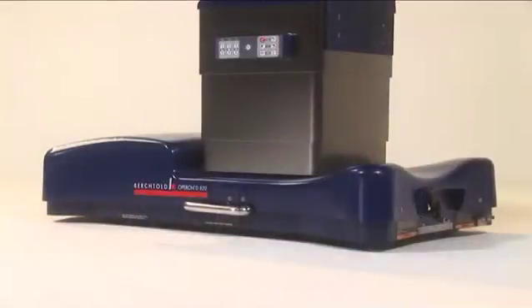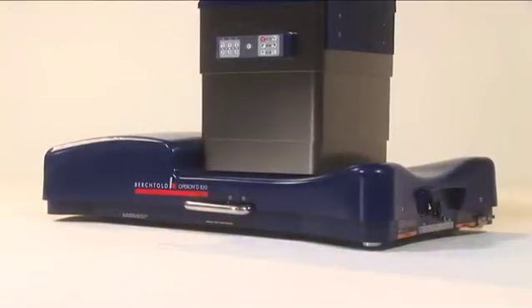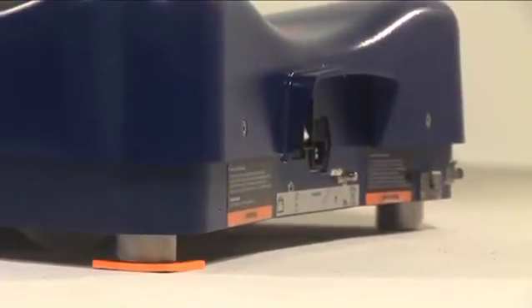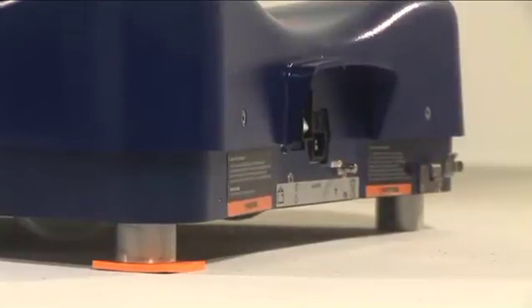To ensure patient and caregiver safety, the D820 is equipped with self-compensating floor locks. If the OR floor surface is uneven, the table will compensate up to one quarter inch to ensure a stable table surface.